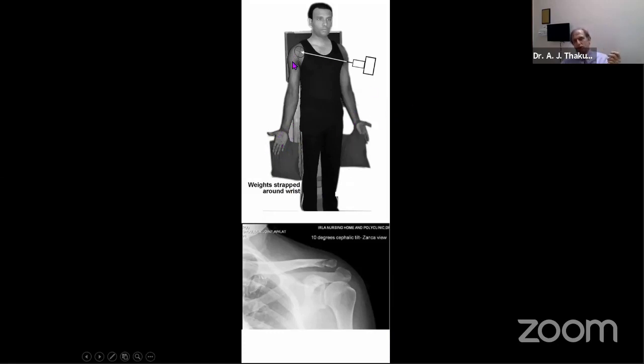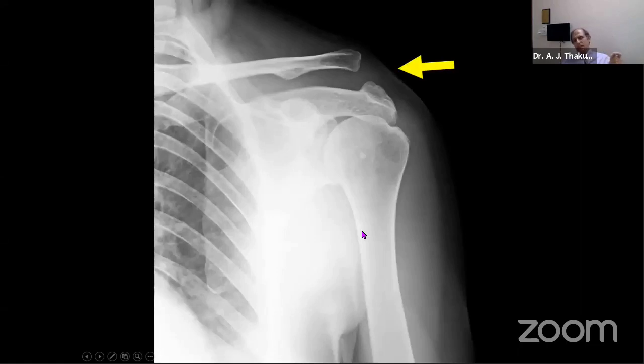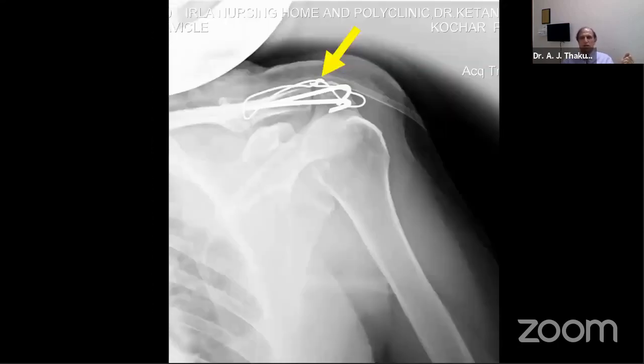With that, there is an automatic pull on the shoulder, and one can see the displacements if there are any. Like here, there's a heavy weight pulling it down, and one can easily see the subluxation or dislocation of the shoulder, acromioclavicular joint, which can of course be fixed in this way, and now there are other ways also of doing it.